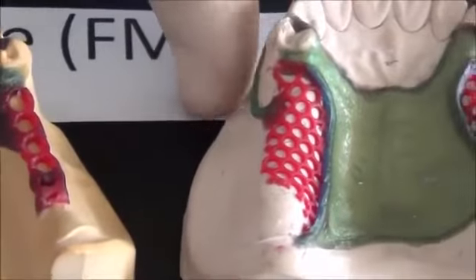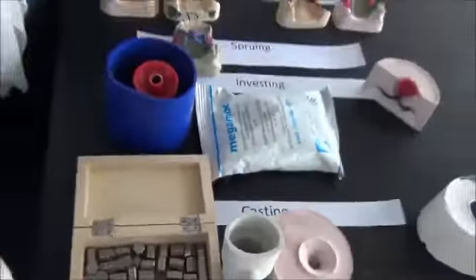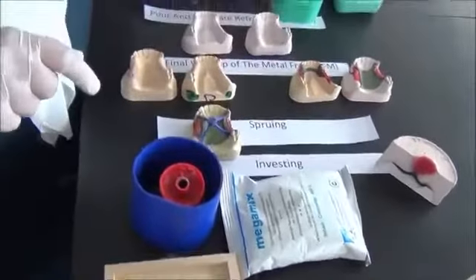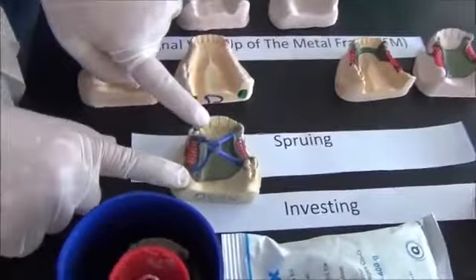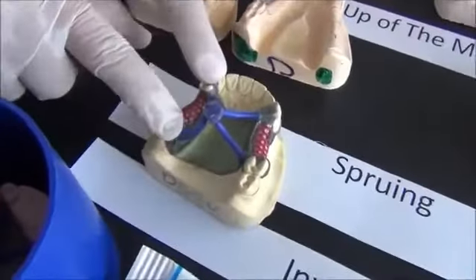These wax patterns are then transformed into metal using the process of casting. It's a process that contains multiple steps, so let us take them one by one. This metal framework is then attached to what we call sprues.